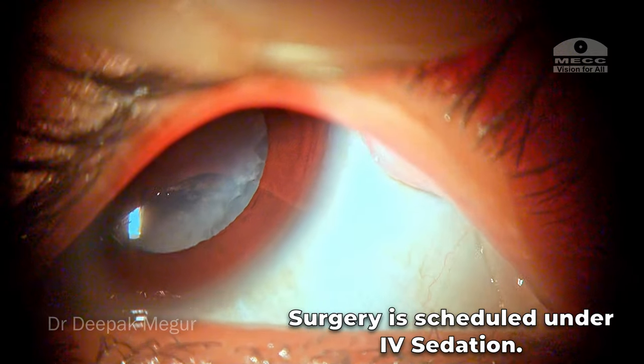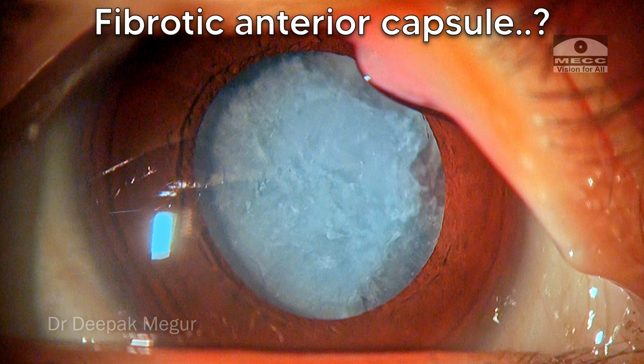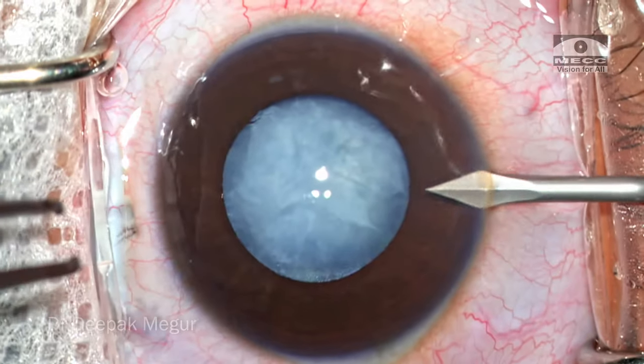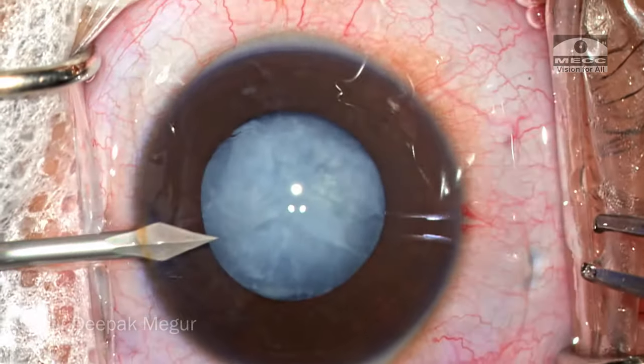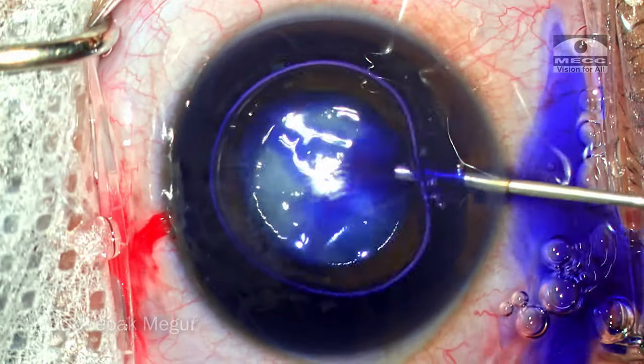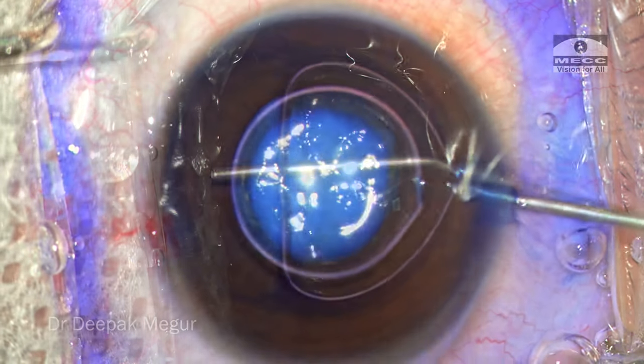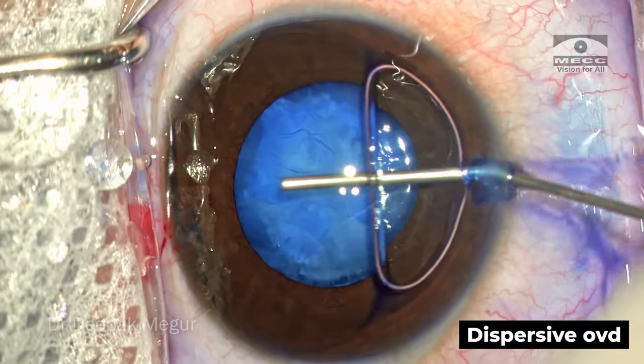The surgery is scheduled under IV sedation. Let's examine the cataract first. The anterior capsule looks quite fibrotic — whether it is intact or not we will know only when we stain it. The two paracentesis incisions are made, the capsule is stained under the air bubble, irrigated out, and then dispersive OVD is used to pressurize the chamber.